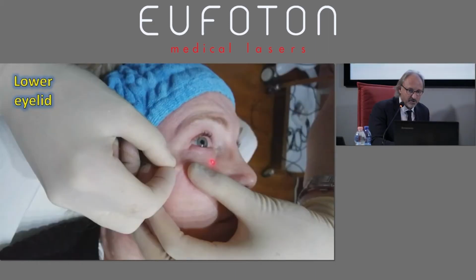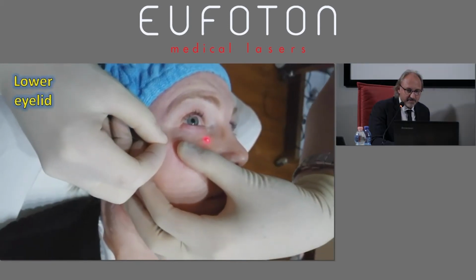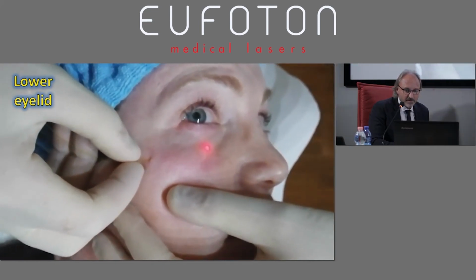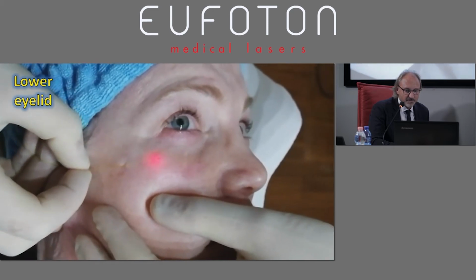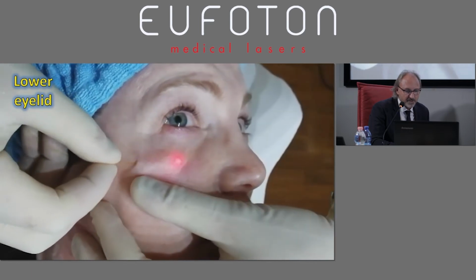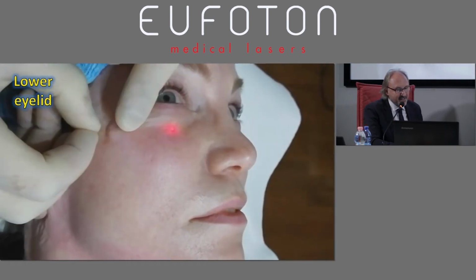That's the video of the technique I'm showing you now. The eyelids, the jaw. So, 300 micron fiber. Retrograde emission, just retrograde energy delivery.